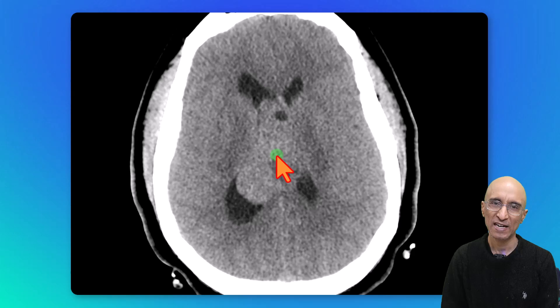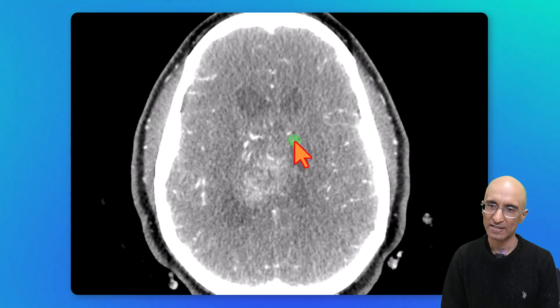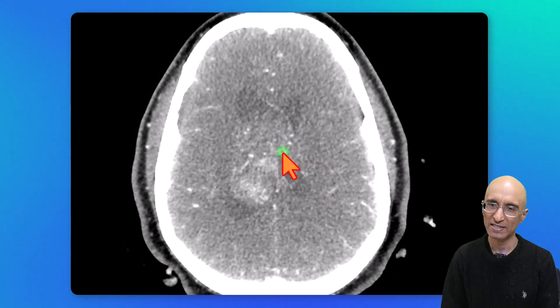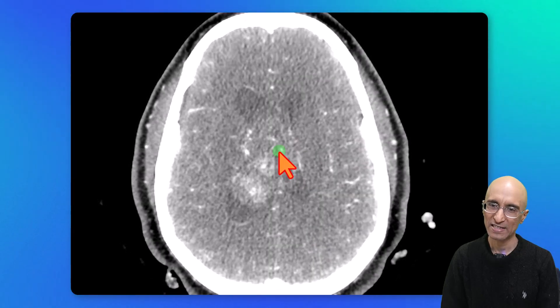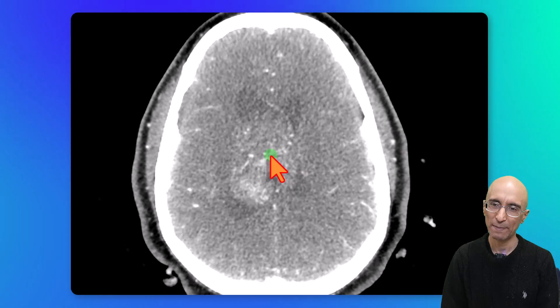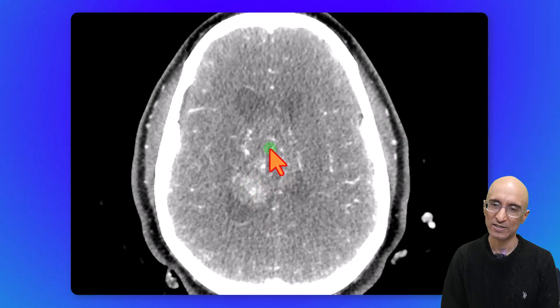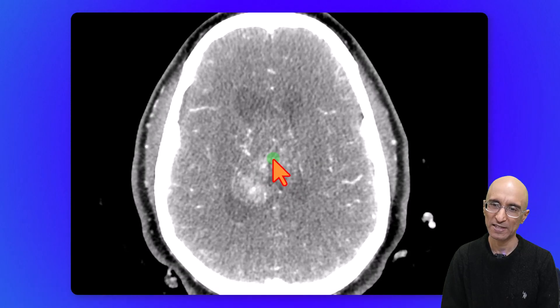The patient underwent CT angiogram as part of the pre-surgical workup. On the CTA, we can clearly see increased vascularity or neovascularity within the mass, and there are a few heterogeneous regions of enhancement within the mass.